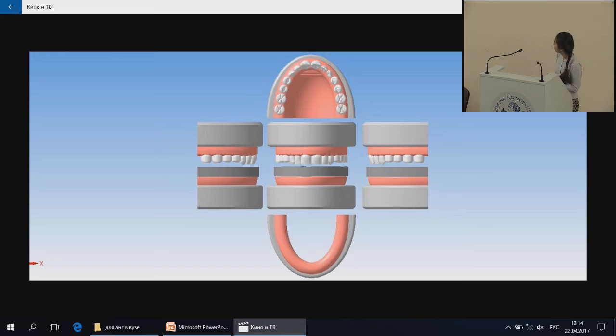After the arrangement of the maxillary teeth, the arch gets a semi-elliptical form that also keeps the stabilization of the denture. Then we start the placement of the lower teeth. We started with the second premolar because it's convenient to determine its amplitude within 2-3 millimeters on the occlusal surface in the articulator. Then we put the first molar and the second one, as you see. Then we put the first premolar. We start with the lateral group of the teeth because they create the fissure-tubercular contacts.